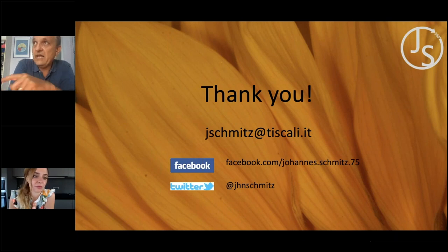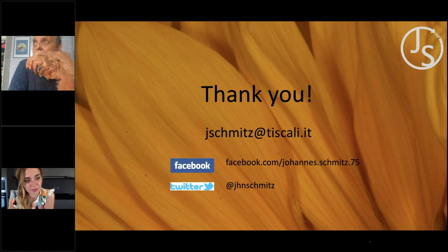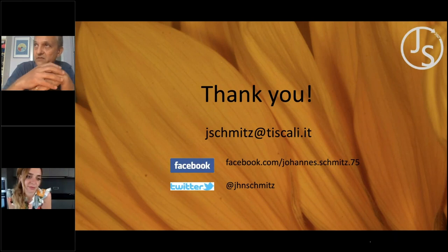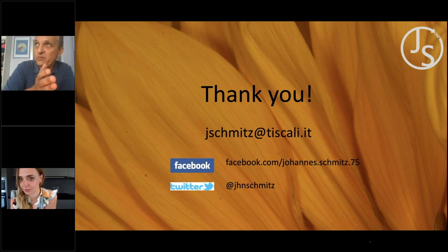And I really trust the things I see, because when you're using very fine articulating paper, then there's really not much else that you can do. Of course, the system is adapting, which means you can still have a muscle that is about to relax and is not yet there, but it will if you stabilize the situation. So then, if you wait 2 weeks, it will do one of two things. Either the occlusion will be off or the EMG will be normalized.